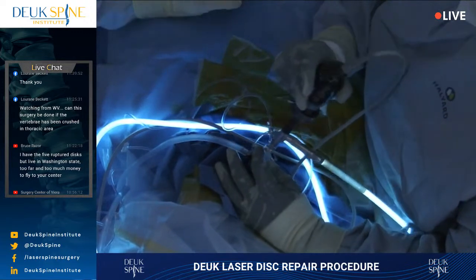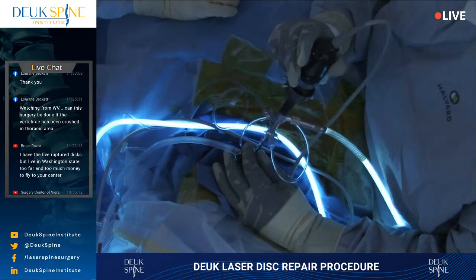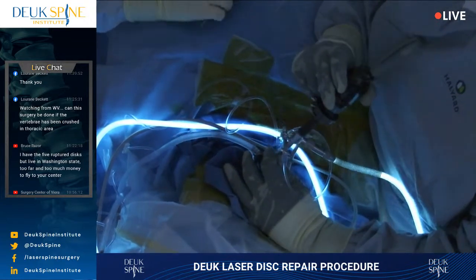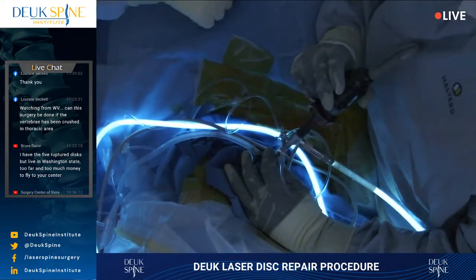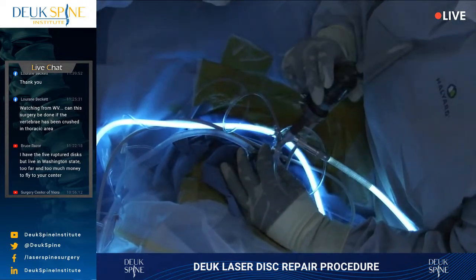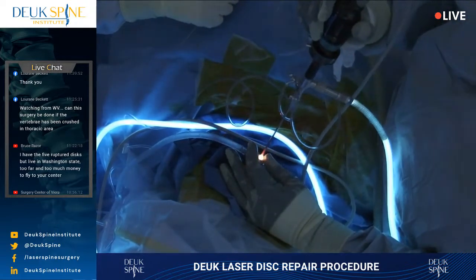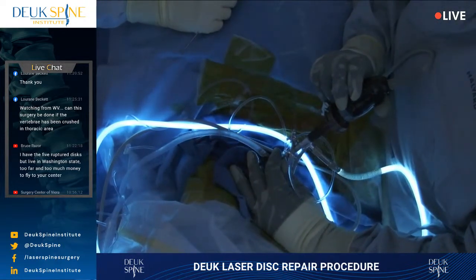All right, so this is actually a very different looking disc than the last one. Look at all this stuff. This is all herniation, by the way, but it's far less scarred than the other one. So this injury is, believe it or not, more recent. Now there's still calcium deposits in the herniation and the annular tear, so it didn't just happen yesterday. It probably happened a few years ago, but it's not like that other one, the C5-6 one, that's probably 25, 30 years old. But this has got a lot more of the disc material.